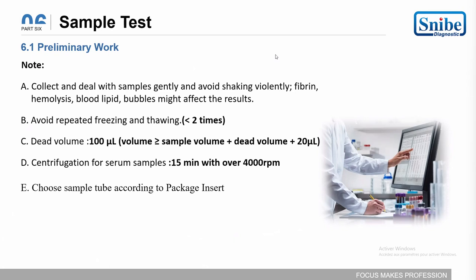Okay, the quality control is not included in the reagent kit vials. It is not integral to the reagent kit. It is another vial inside the box of the reagent kit, but it's not in the 7th vial.